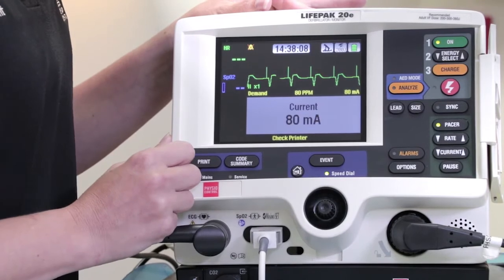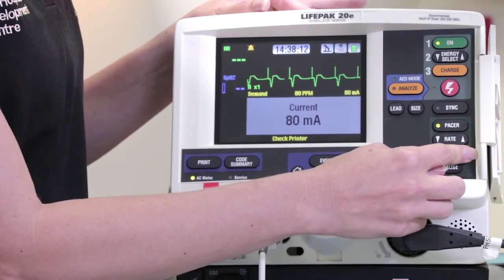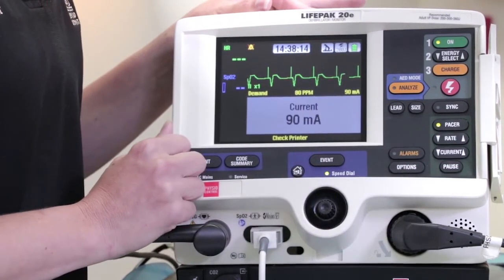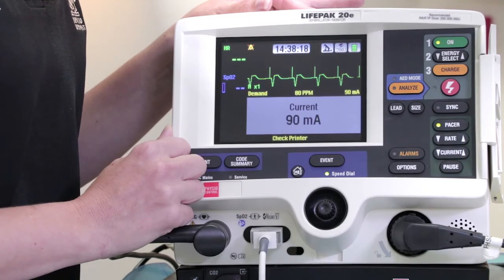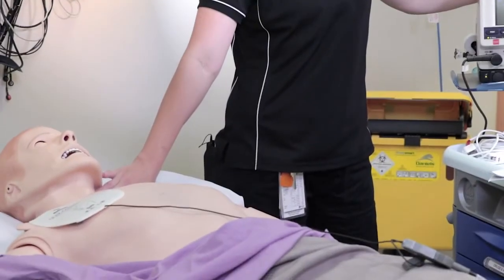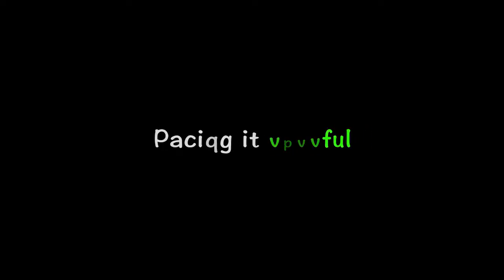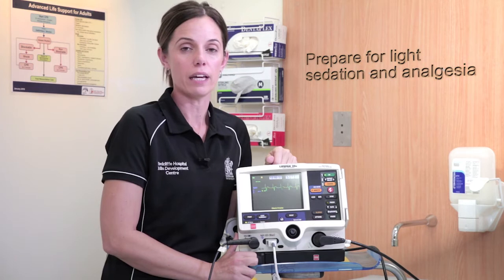Once capture is observed, increase current by 10 milliamps as a safety buffer and check the patient for a physiological response or mechanical capture. Is there a pulse and how does it correlate to the pacer? How's their blood pressure? Pacing is painful, so prepare for a light sedation and analgesia.